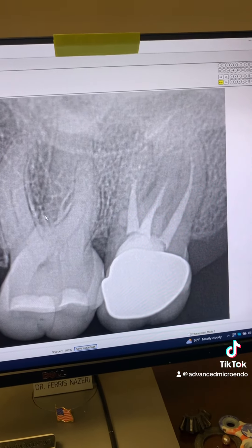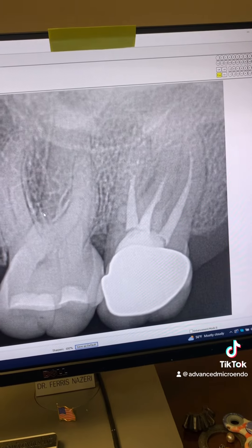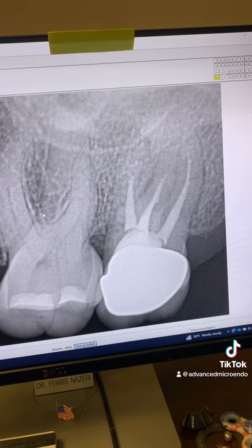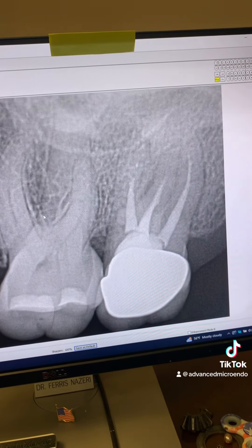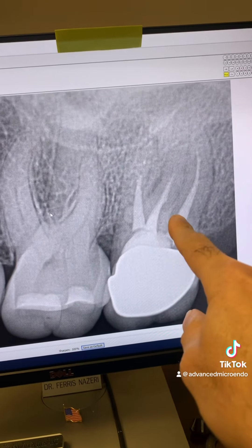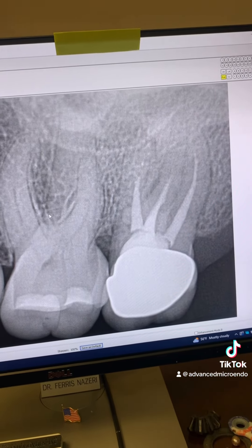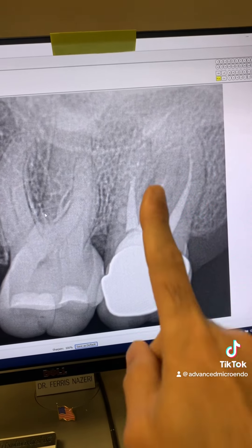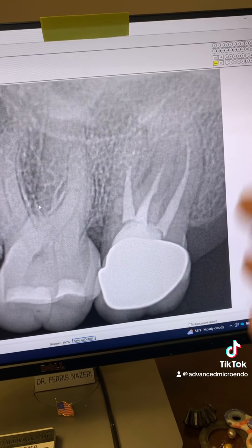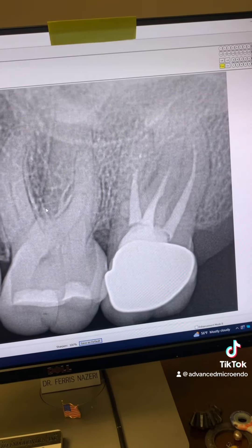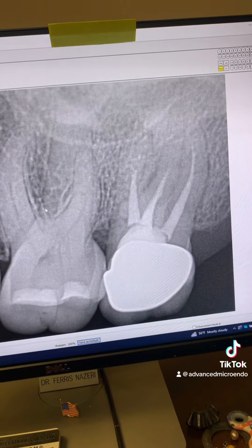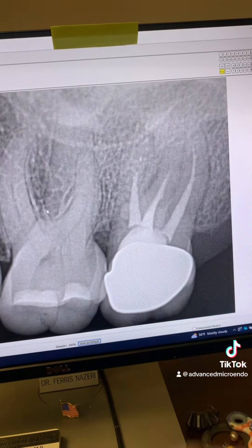And here comes what I always tell you: never, ever rely on just one angulation PA — just one PA to make your diagnosis. Never, ever do that. And here's why.